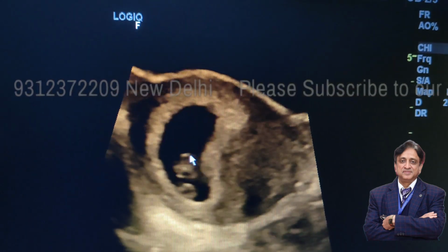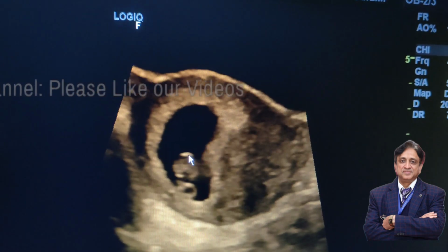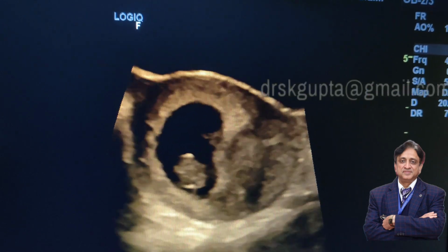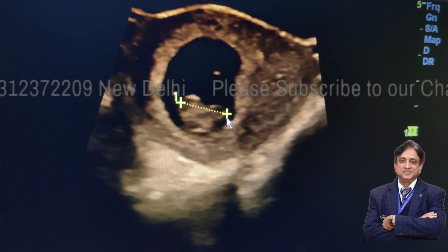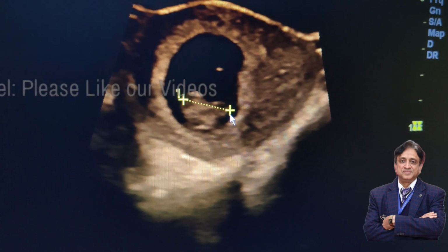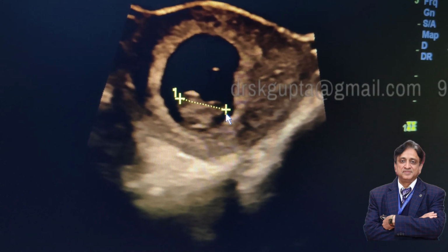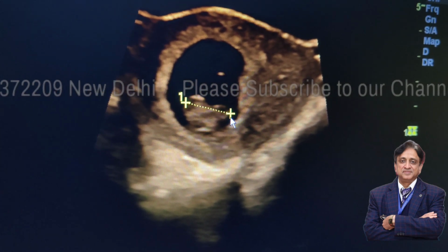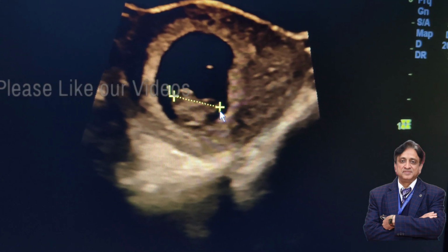And this is the fetal pole, and you can see that the fetal pole occupies a significant portion of the gestational sac. And inside the fetal pole, you are likely to see the cardiac activity. But before that, you should measure the crown rump length. It is very important that you should not include the yolk sac in the measurement of the crown rump length. Sometimes it might be difficult, especially in pregnancies of nearly 7 to 8 weeks of gestation, to know the exact position of the crown and the rump, but the nearest good position should be measured, and the crown rump length is the best way to find the gestational age.